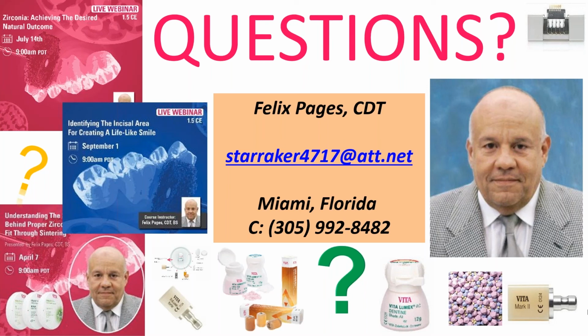Now, if you're going to use a 5Y zirconia, cubic zirconia, like a high cubic, and you blast it too hard on the inside, you can weaken it by half the strength in like nothing. And so I don't know why someone would want to do that, because it'll never be as good looking as a VITA block or a glass ceramic crown or a milled Suprinity or a milled Emax CAD or whatever you want to do, as long as it's a soft translucent look.